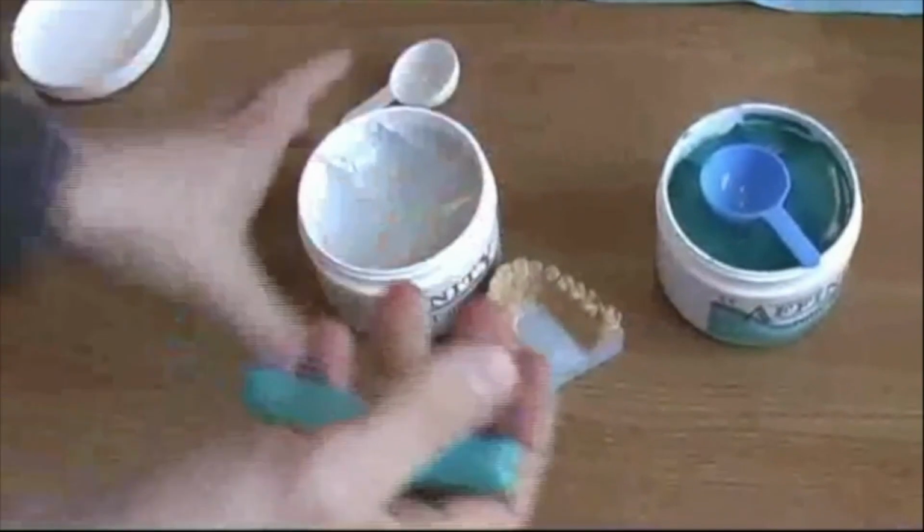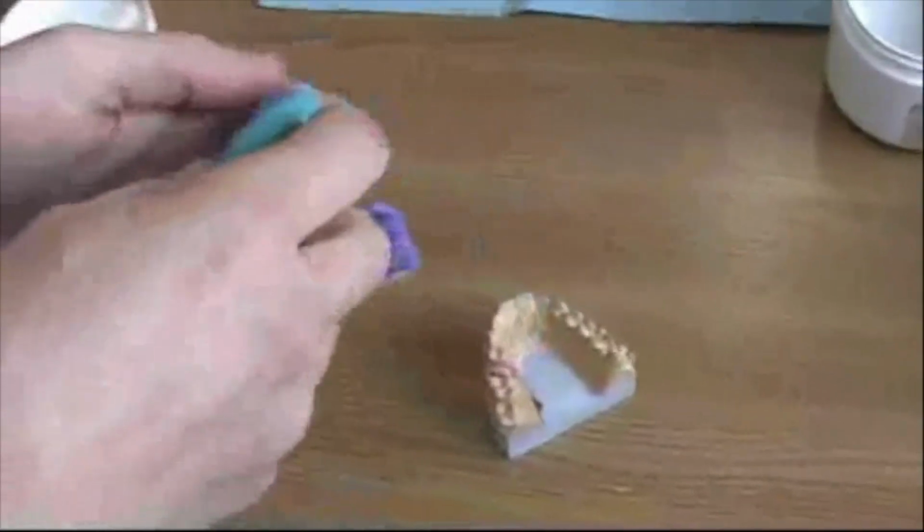Once you've done that, you create a cylinder-like shape, and you place it in the impression tray. See, that's the moment. It's like a sausage. And you put it in the tray. Nicely.